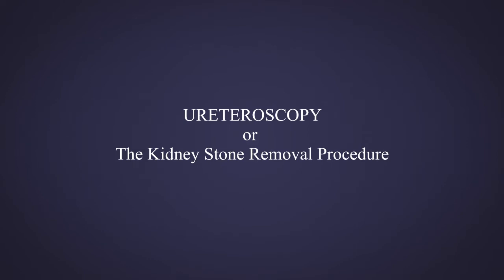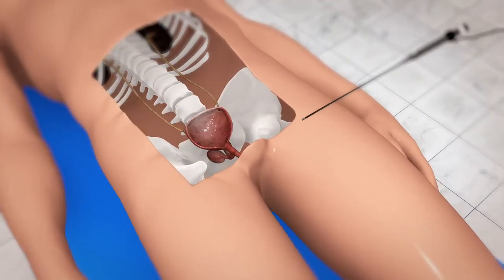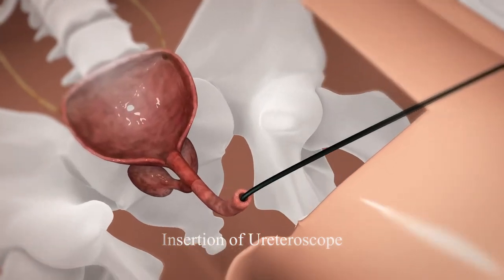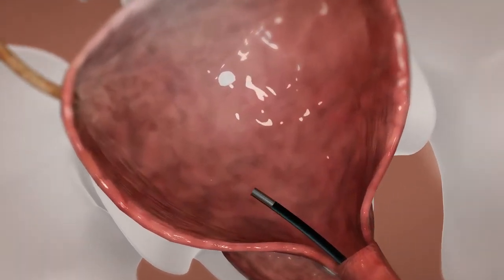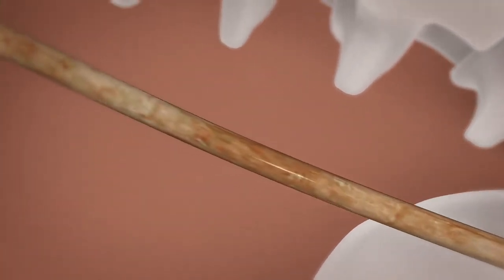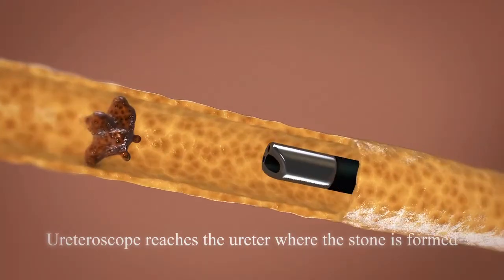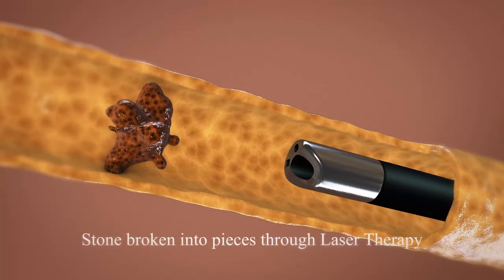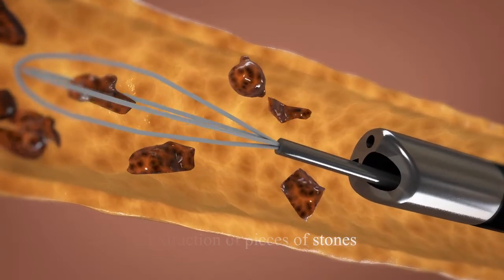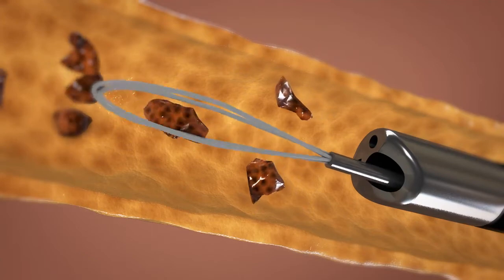Ureteroscopy — the Kidney Stone Removal Procedure. Insertion of ureteroscope: the ureteroscope is inserted through the urethra to see the rest of the urinary tract. The ureteroscope directly reaches the ureter where the stone is formed. The stone is broken into pieces through laser therapy. The broken pieces of stones are then extracted and removed. The fragments of stone generally get cleared through urination.